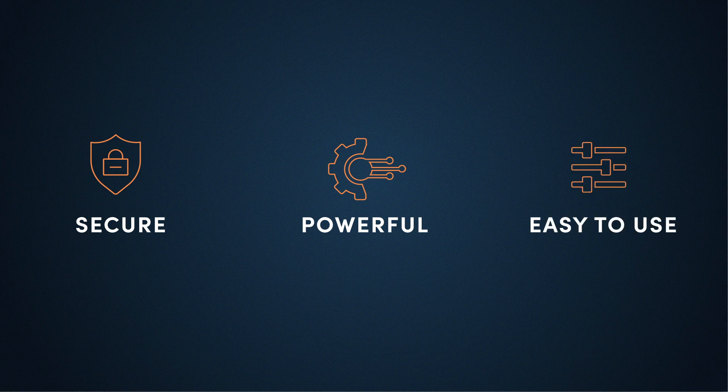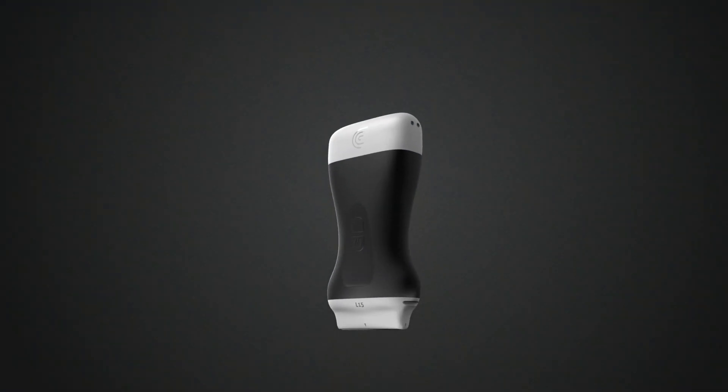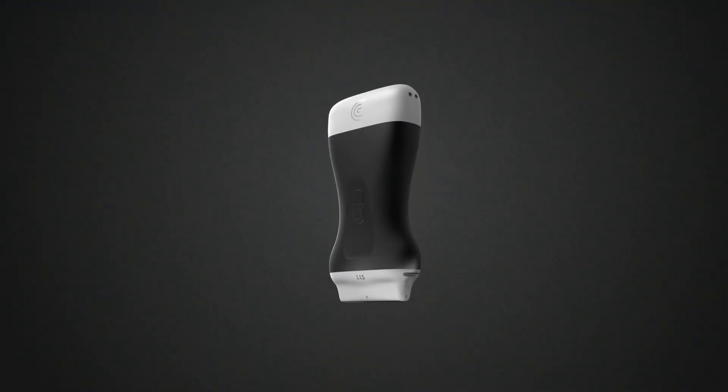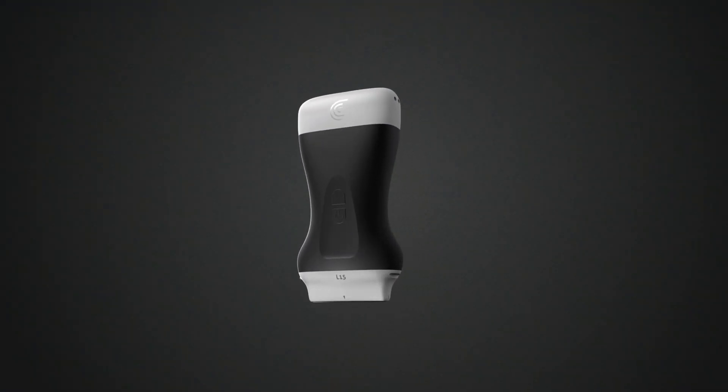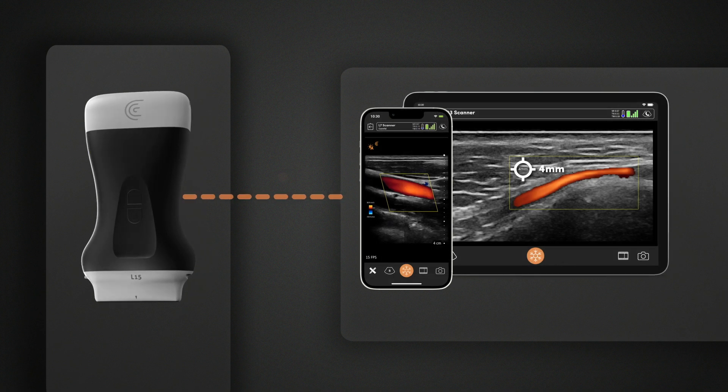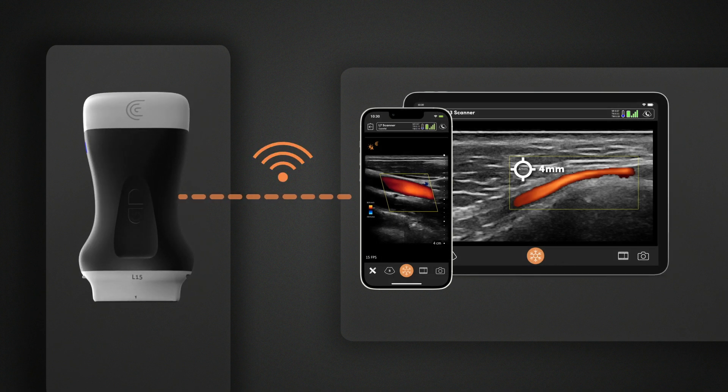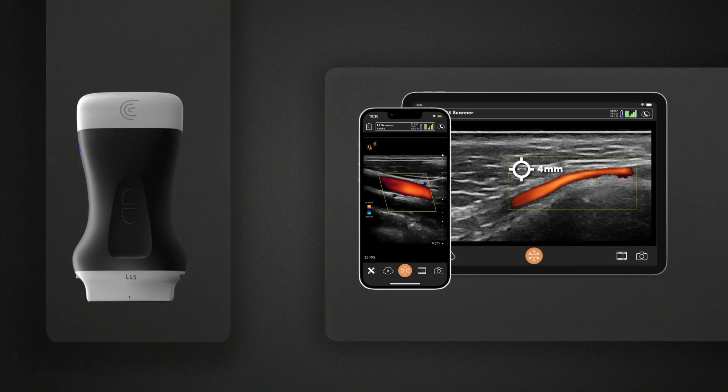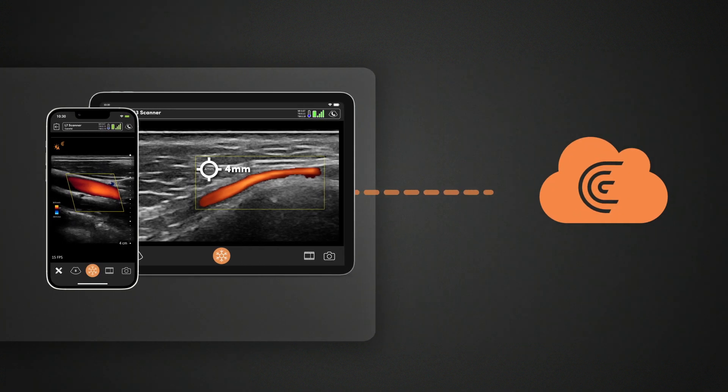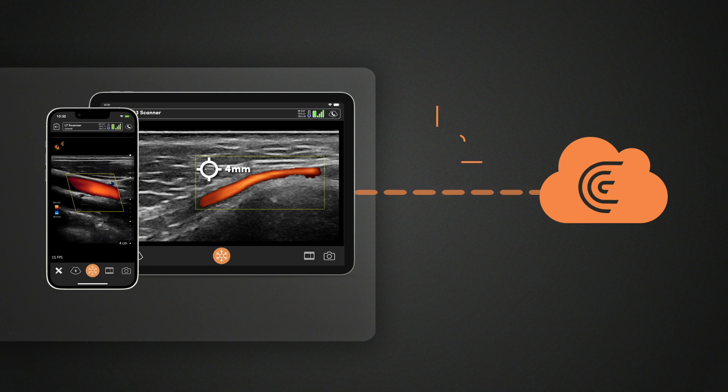While you're using a Clarius scanner, exam data and patient information are first stored on your smart device. Exams are uploaded to Clarius Cloud over encrypted HTTPS when an internet connection is available.